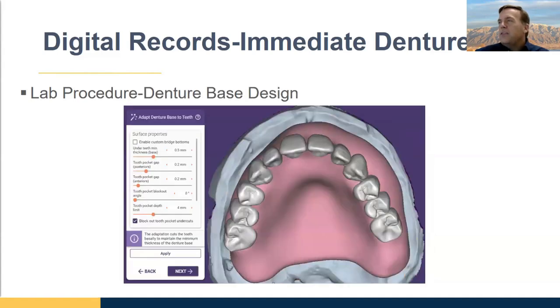All right, so you've got your teeth designed. The next thing is you'll design your denture base. Of course, your laboratory needs to set the borders at the right length, and then the software will propose a pink design, and it's usually pretty marginal. So you have to shape it up so that it has good anatomy.